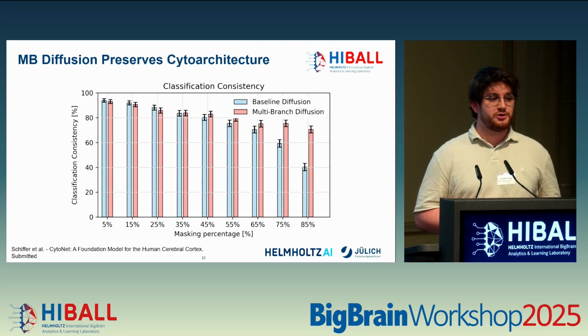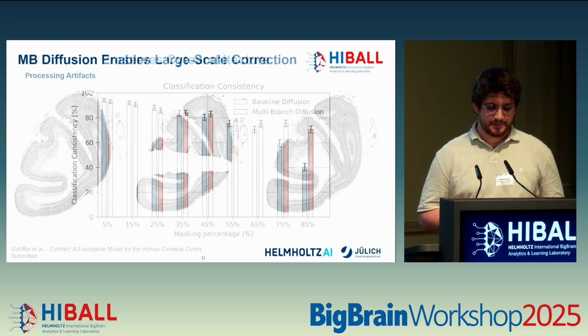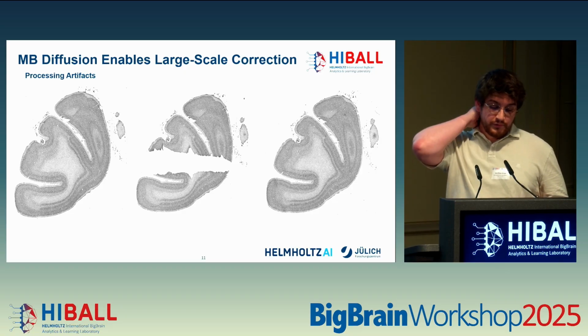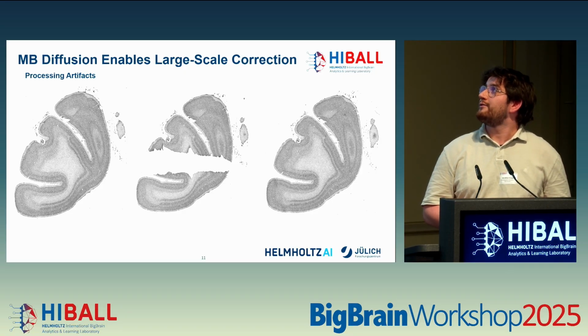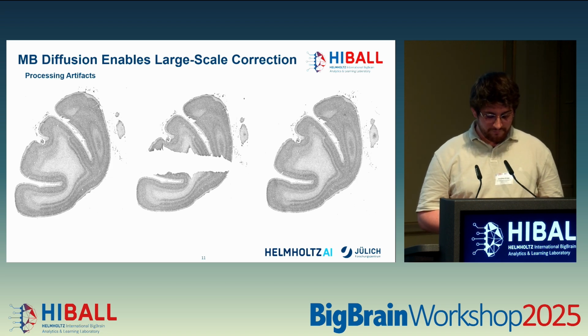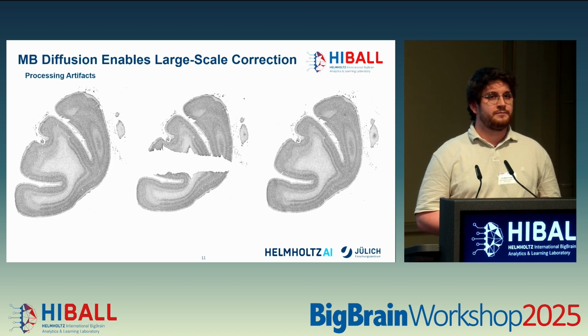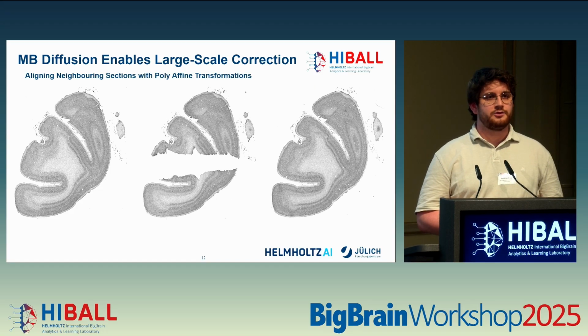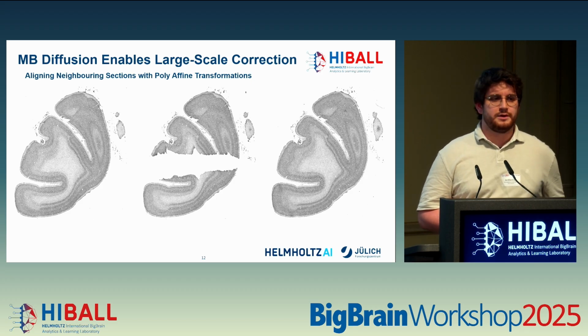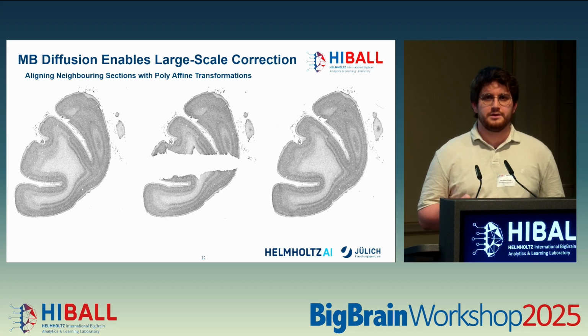Now that we've seen the evaluation part, let's have a look at some real-life example. Here I brought 3 consecutive sections with the one in the middle having a rather large rip, and we would like to fix that. In order to do that, first we align the 3 sections together. This uses LightGlue and some polyfit transformations, which have been developed in-house with Marcel and me.